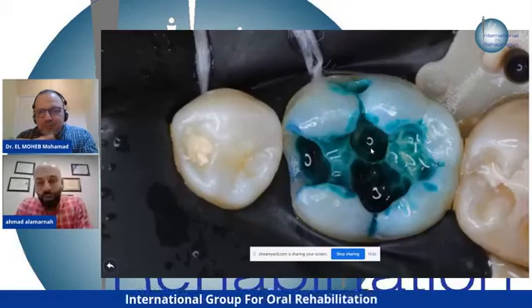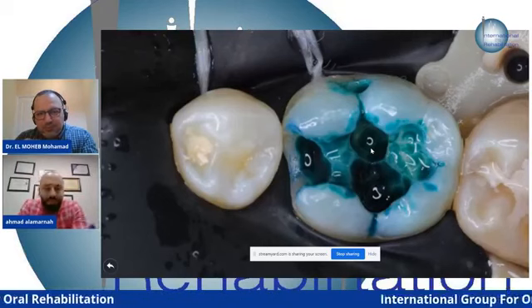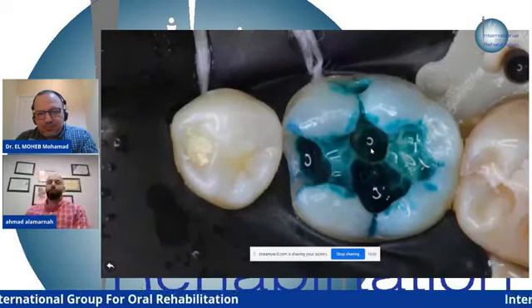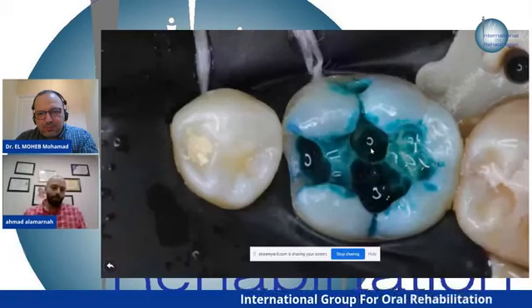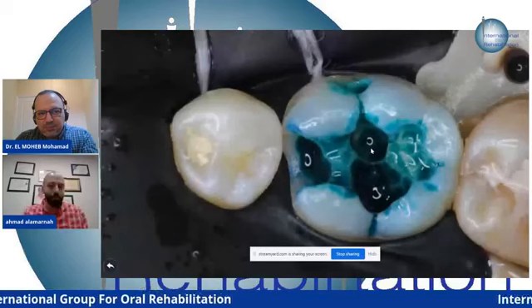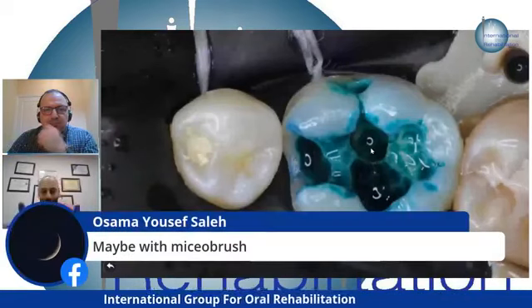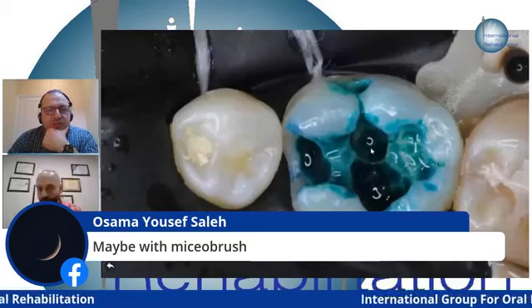Okay, so when I use the caries indicator, first of all, I have to know that there is a smear layer on the dentin surface or any surface of the tooth after you finish preparing your tooth. So if you use the caries indicator immediately, it will stain because of the bacterial byproducts and the dirt in the cavity, so it will stain and you will remove more of the tooth.